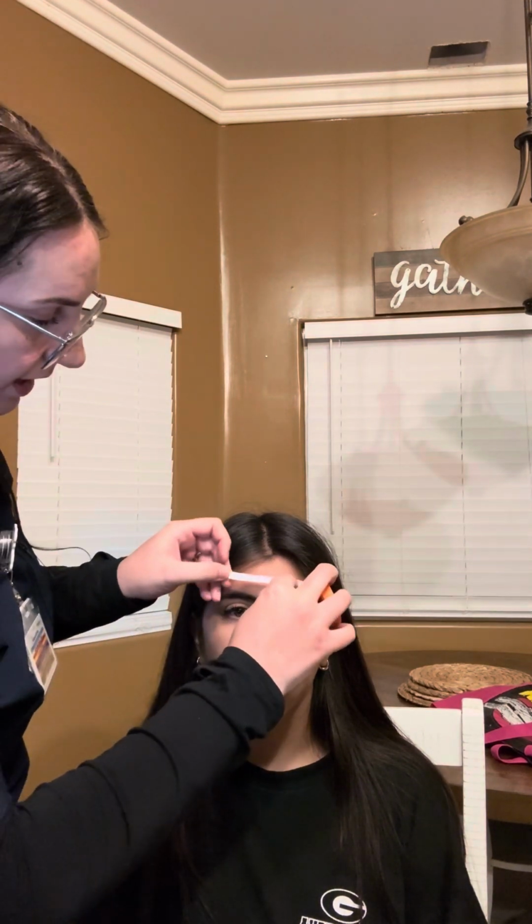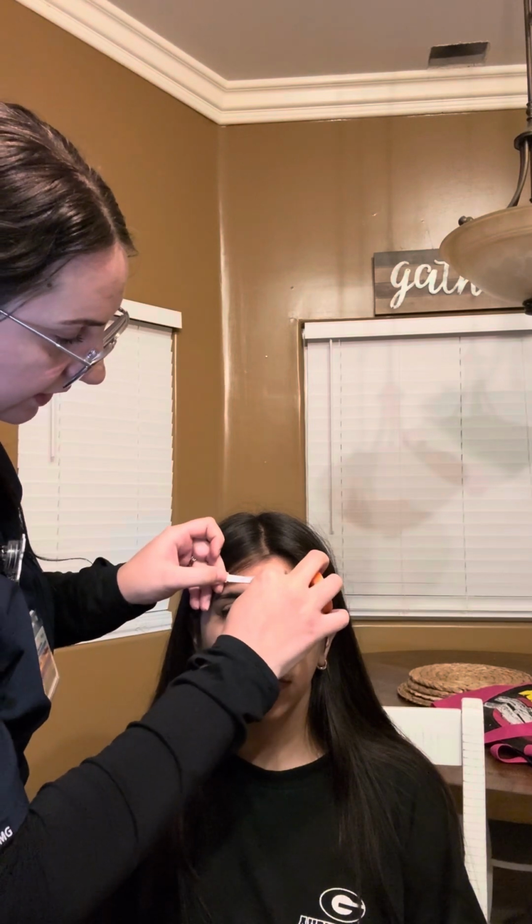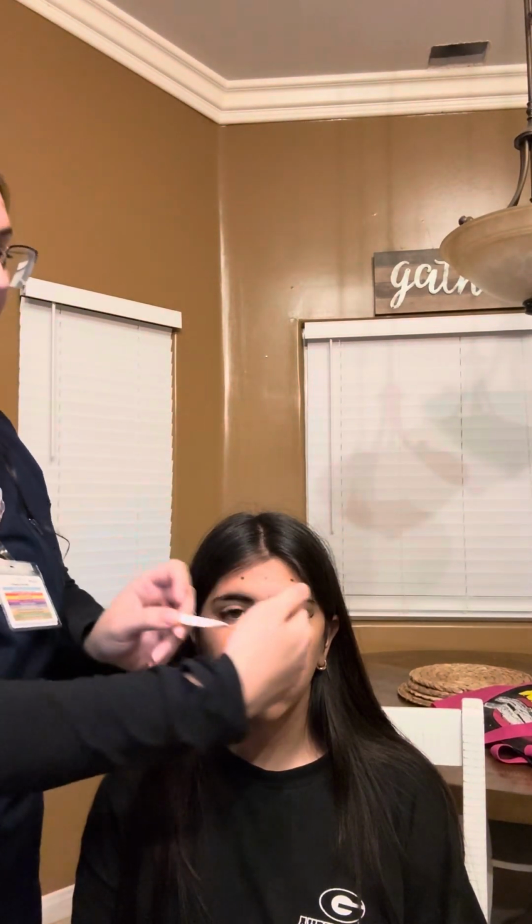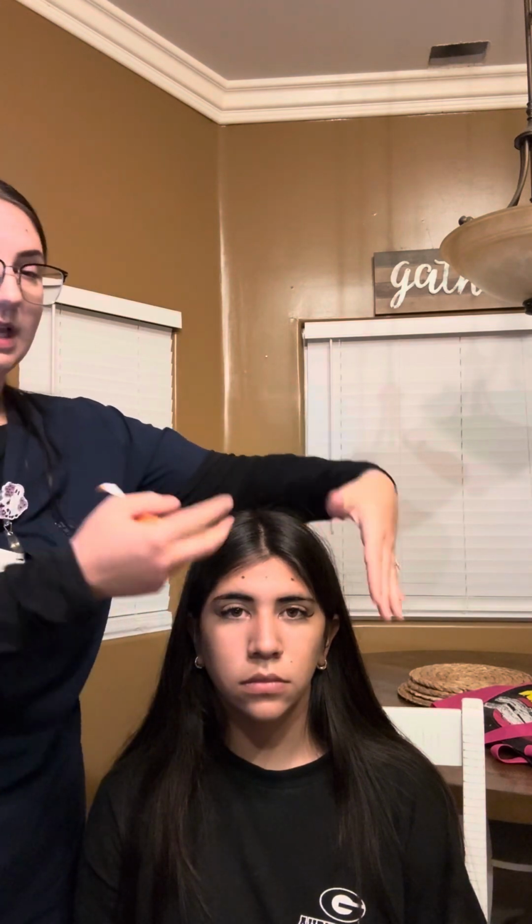Go here, you can flip it over to there, and it's the same thing for the left and the right, FP1 and then FP2. So this was FP1, this is FP2. After that, you want to get O1 and O2, which is from the occipital.